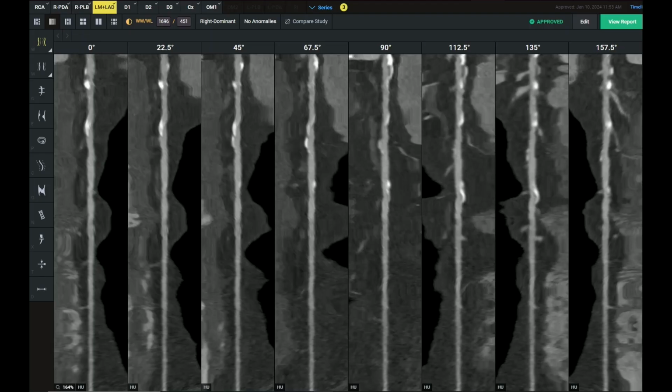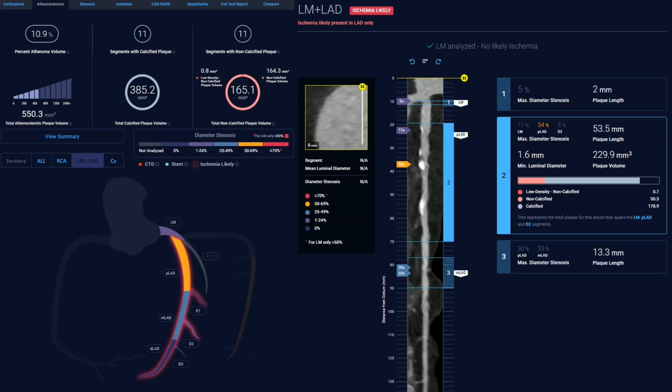Calcium score is 996 there on the bottom left. Here is a display of his plaque, and then here's the Cleerly AI detected plaque overlay, again, really just right where my eyes would train towards the predominant amount of his plaque. And in this patient who's symptomatic, we ran the ischemia tool on him. And in the LAD there, you can see that the AI read was indeed in CAD-RADS 3, and that vessel looked like it's likely to be ischemic based on the AI.